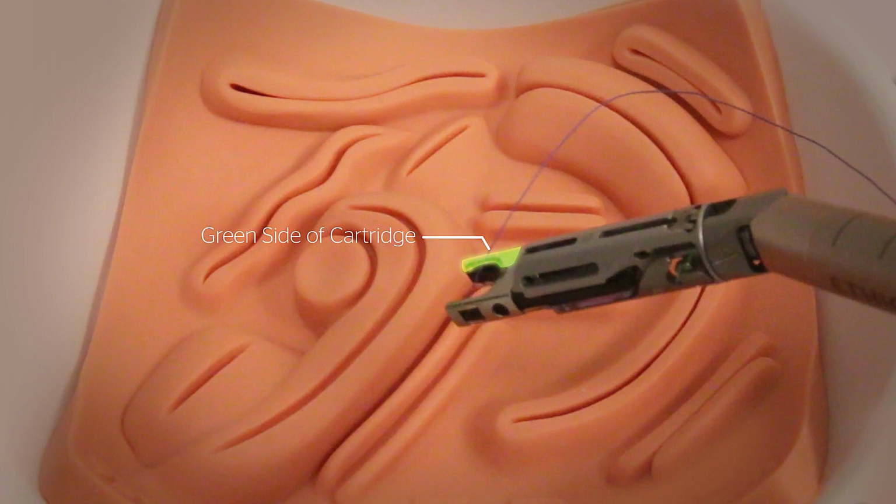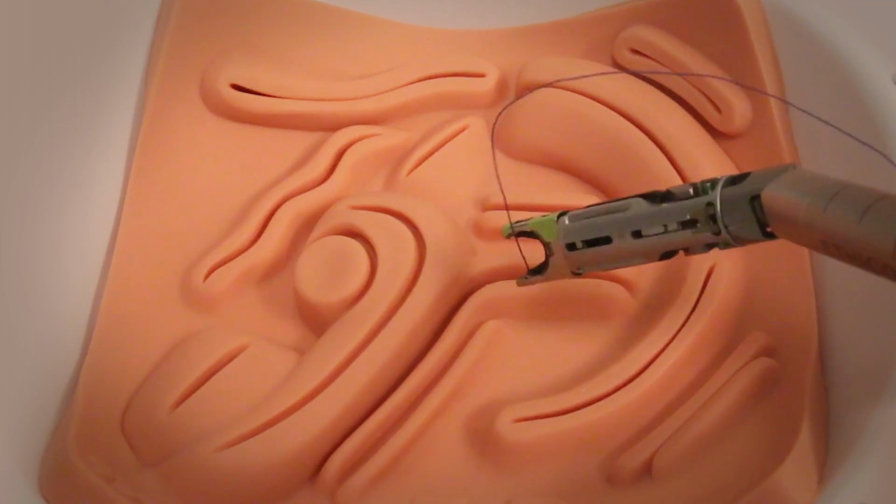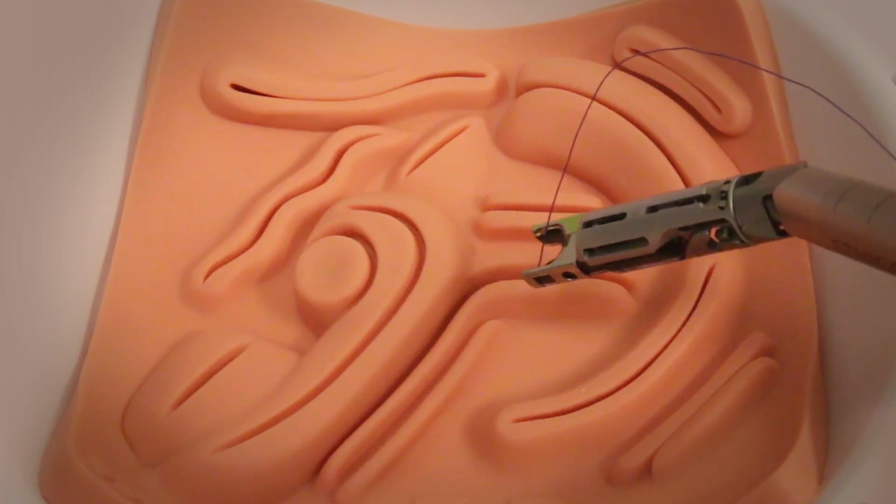Place the green side of the cartridge on the target tissue. The curved needle will exit from the green side of the cartridge. Articulate and rotate the distal tip if necessary to achieve the desired angle and placement.